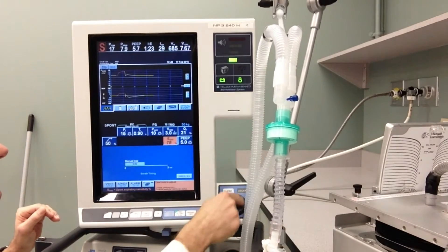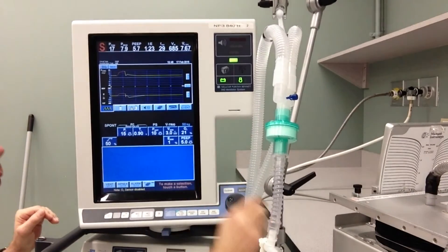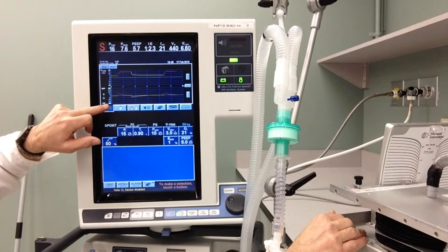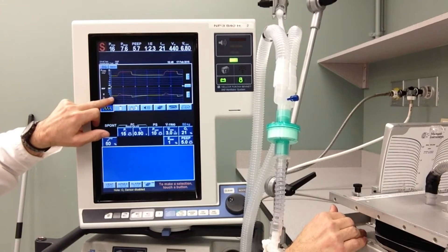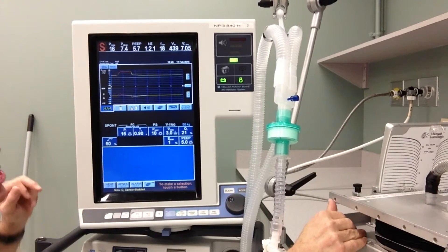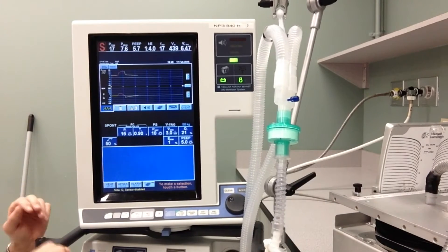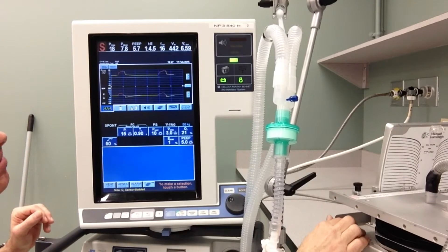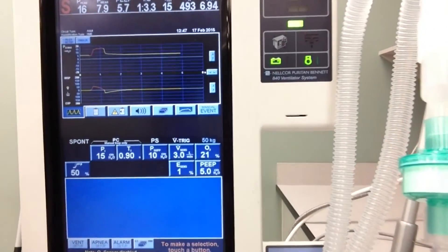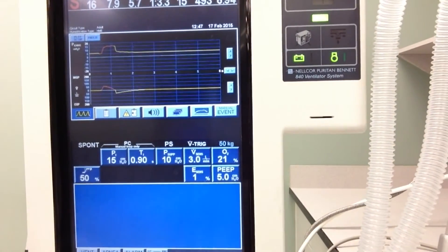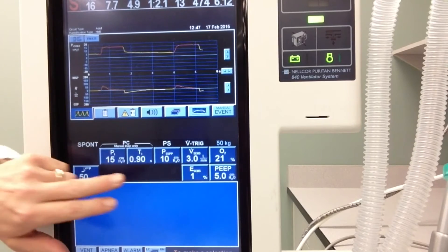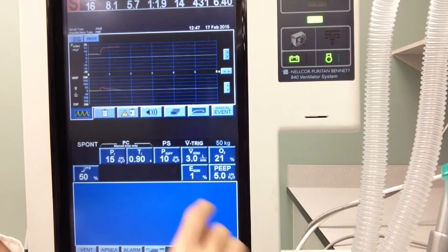When I change the e-sensitivity to be very low — to 1% — you'll notice there's a long, deep, prolonged inspiration, where the inspiratory flow has to go from 100% (which is about 50 liters per minute) down to almost zero before the ventilator will cycle into exhalation. This is the inspiratory flow declining to 1% of my peak flow before it goes into exhalation.